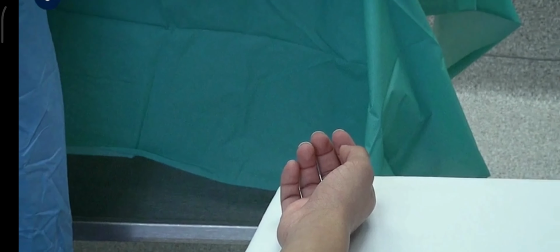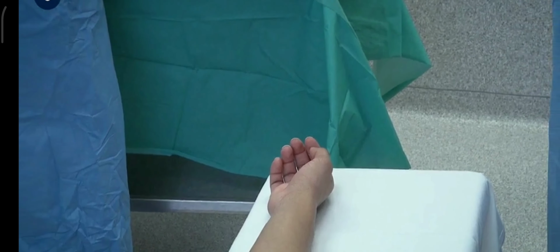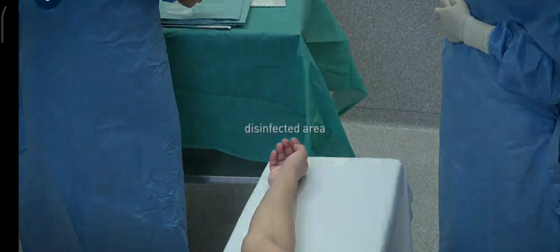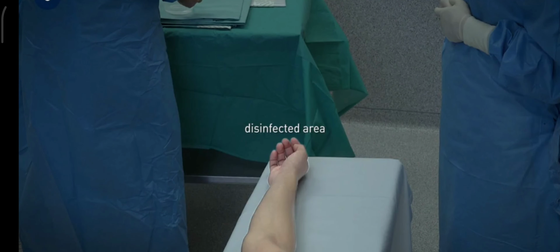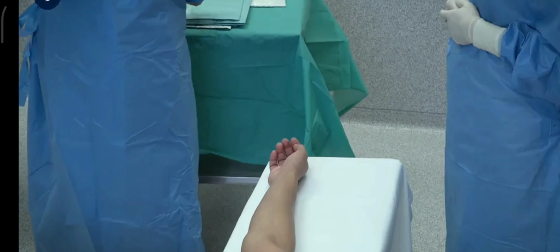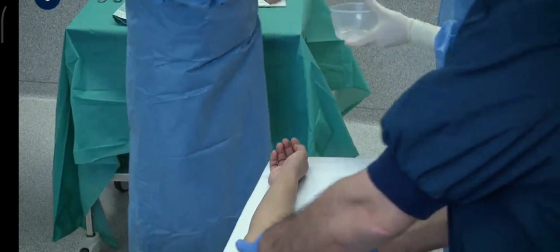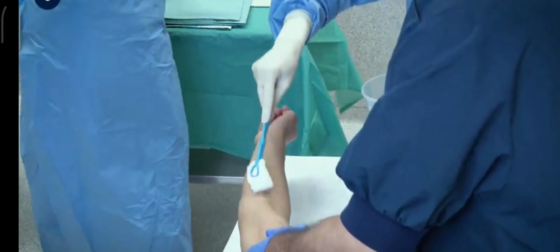In this film, cleaning and disinfection of the forearm as well as the hand will be demonstrated, as well as 2 draping techniques for the same. To clean the surgical site, the arm must be lifted by an unsterile assistant. This is done with spatial awareness that allows scrub nurse and surgeon to work without the risk of contamination.